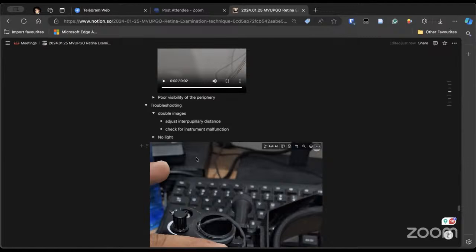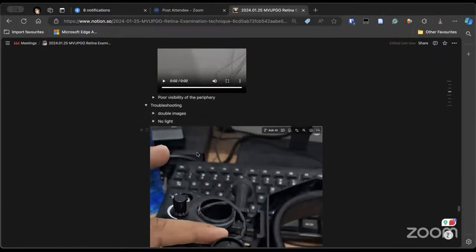But most commonly, such things will not happen to you, because other candidates will be seeing through the same microscope, and most likely it will not happen. If the light is not there, what can be the reason? There is no light. Has to be charged? Yes, but before charging, I'll tell you to see that the switch is on, and check if there is any lever in between. The lever is one of the major causes.